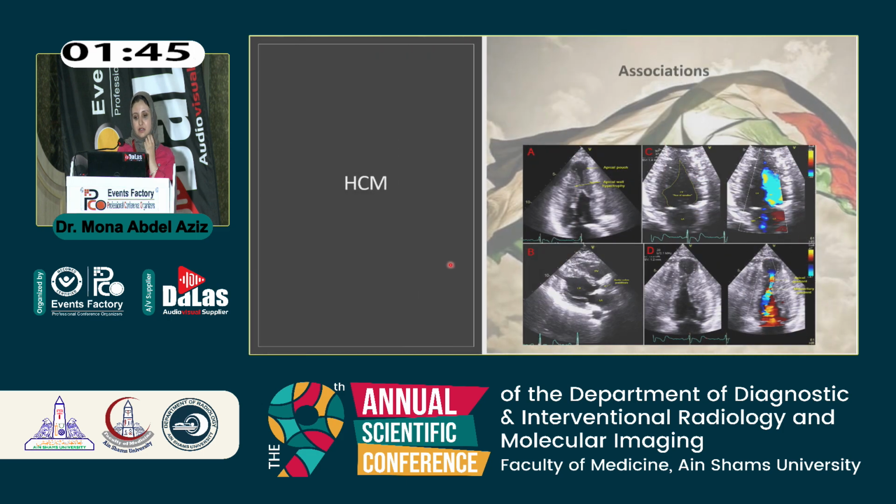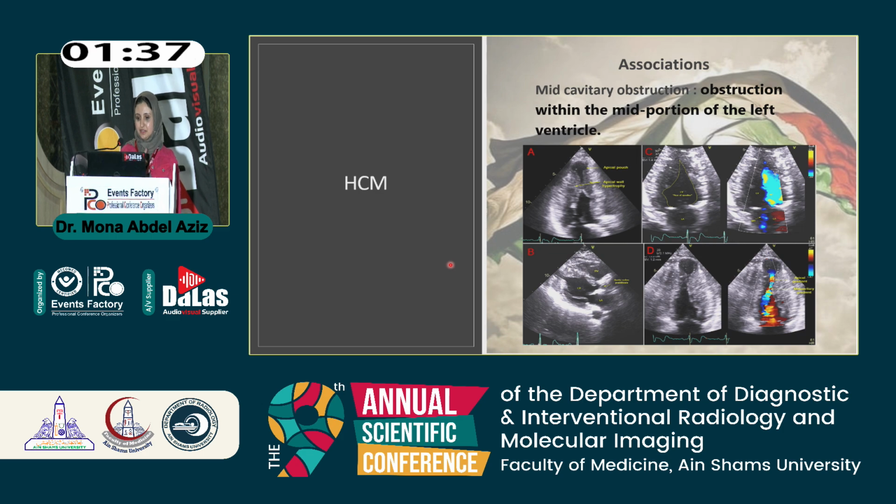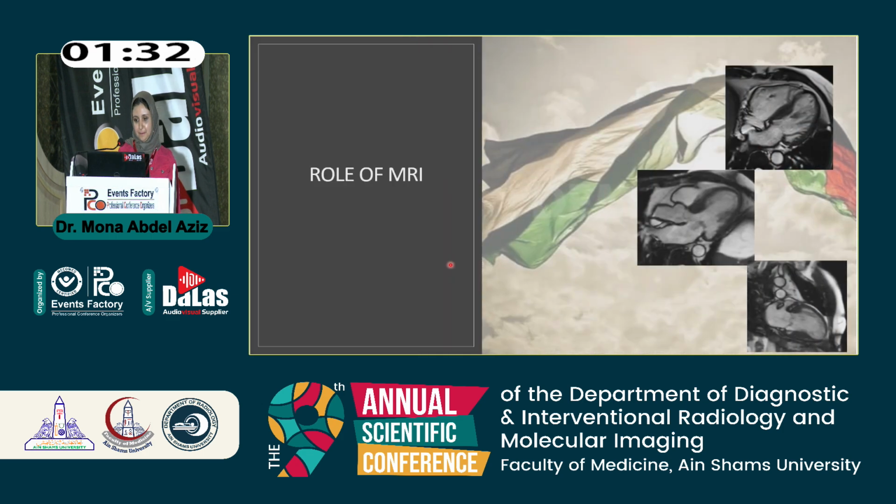Also, there is another association that can be present, which is a mid-cavitary obstruction, as it is an obstruction within the mid portion of the left ventricle. It can be detected by echo and then confirmed by the MRI.